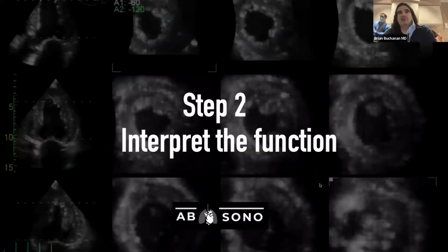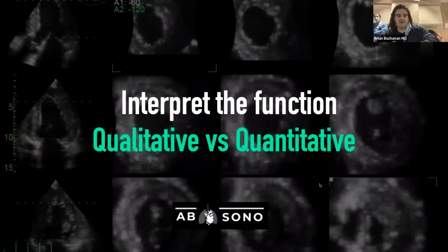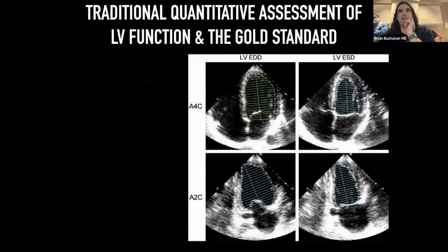So interpreting function. We step up here in complexity: qualitative versus quantitative. We're going to start here with what's done as per the normal standard. If you look at quantitative assessment, you look at diastole, you look at systole, and you compare the volumes. How much blood is truly ejected from diastole?